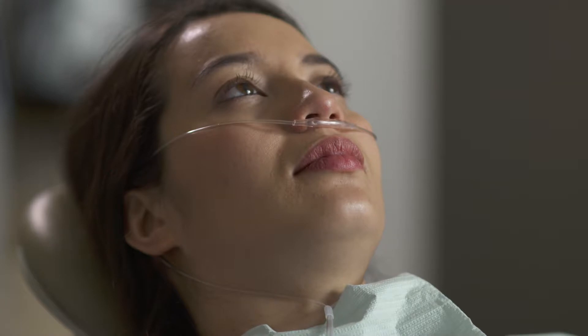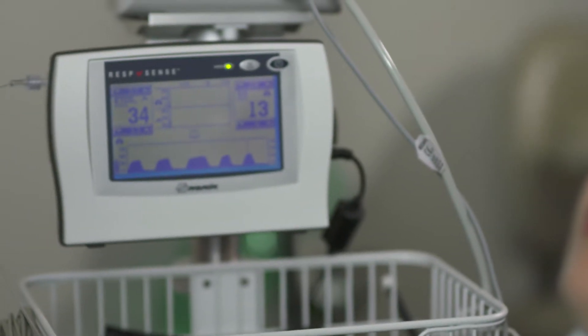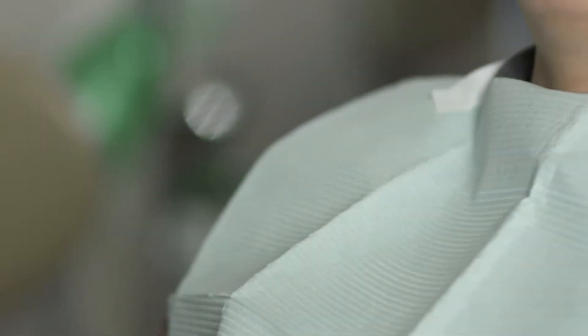Nasal cannulas capture exhaled air only from the nose. These work well for many patients as long as they continue to breathe through their nose. However, for patients who are mouth breathers, you may consider using an oral-nasal cannula.